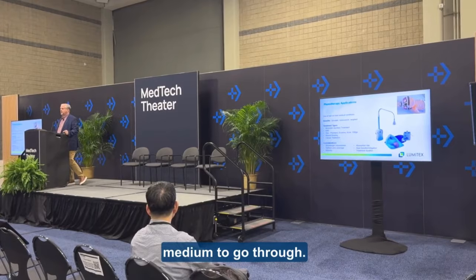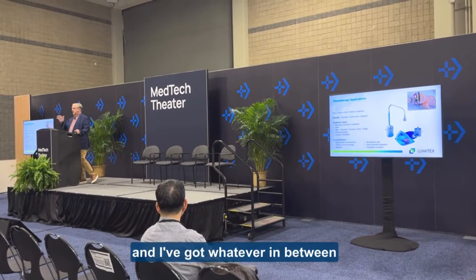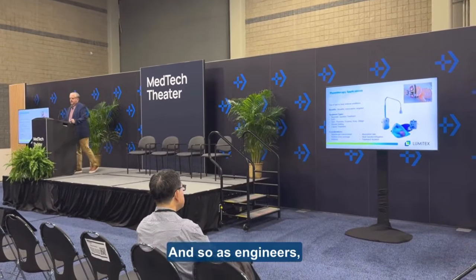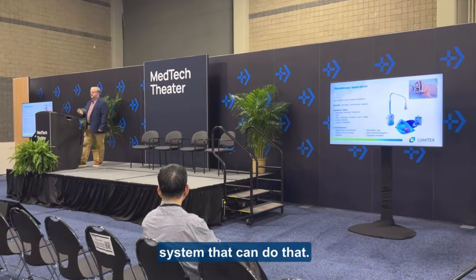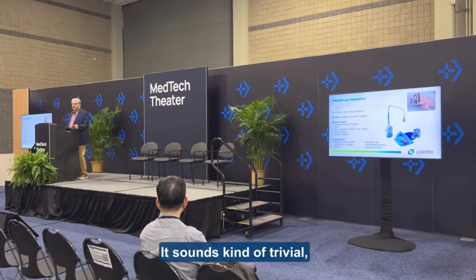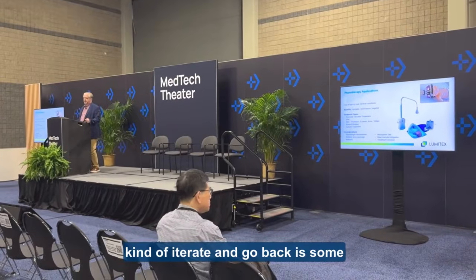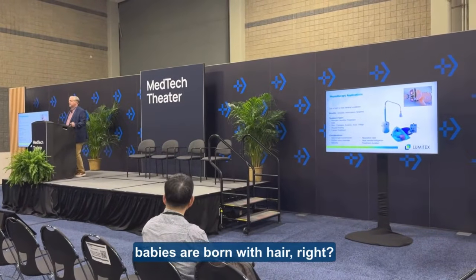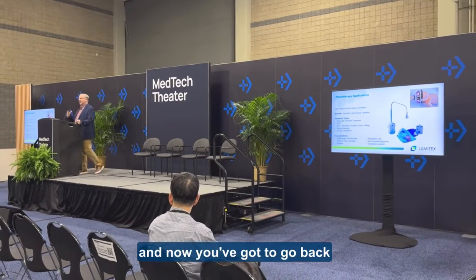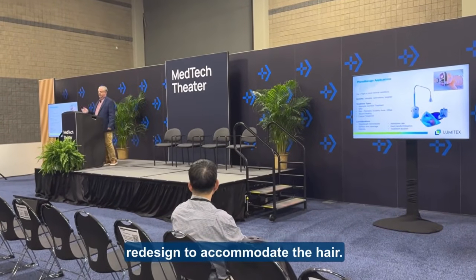I've got quite a bit of medium to go through. I've got different media. I've got skin, I've got the skull, and I've got whatever in between to reach the brain. And so, as engineers, we were able to develop a system that could do that, but there was one fundamental thing we forgot earlier in the process. It sounds kind of trivial, but it turned out to be something we had to iterate and move back on: some babies are born with hair, right? So if you think about it, you design this thing, you forgot about the hair, and now you've got to go back and revise, redesign to accommodate.